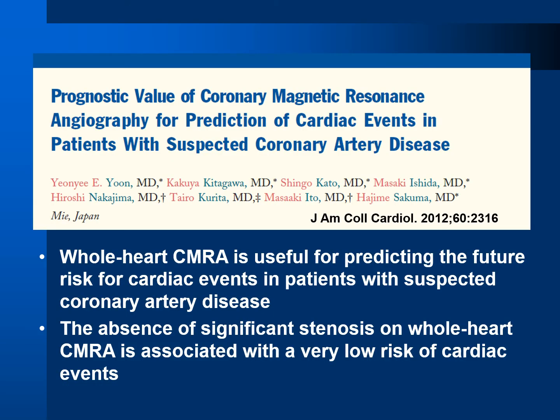Dr. Sakuma's research group also proved the prognostic value of coronary MRA. Whole-heart CMRA is useful for predicting future cardiac events in patients with suspected CAD. Also, the absence of significant stenosis on whole-heart coronary MRA is associated with very low risk of cardiac events.